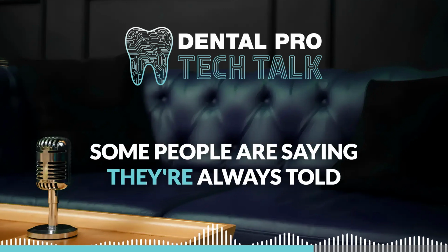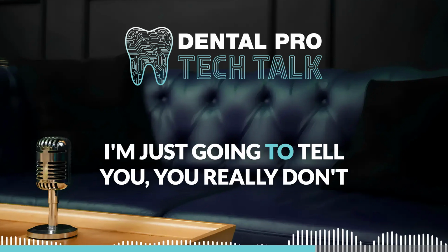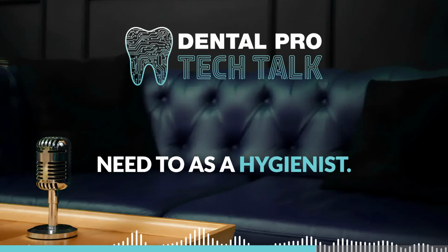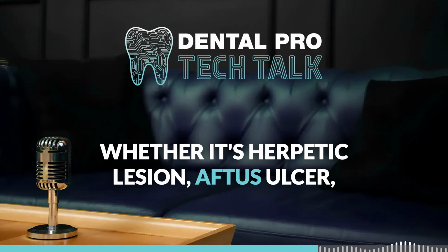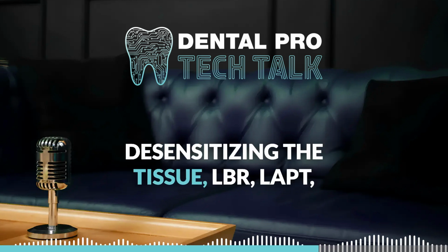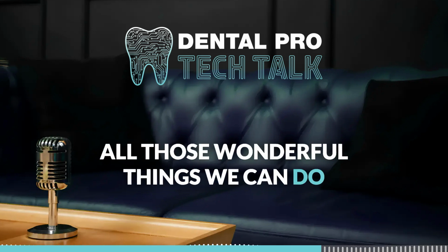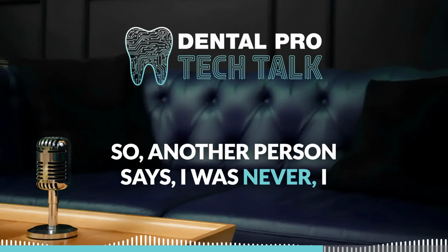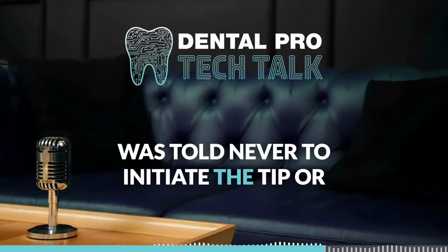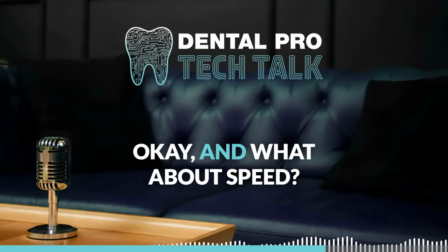Some people are saying they're always told to initiate the tip. I'm not going to tell you that's wrong. I'm just going to tell you you really don't need to as a hygienist. You can use an uninitiated tip, whether it's herpetic lesion, aphthous ulcer, desensitizing the tissue, LBR, LAPT, hemostasis, all those wonderful things we can do with an uninitiated tip in hygiene. So another person says, I was told never to initiate the tip or to replace the tip if that became initiated.